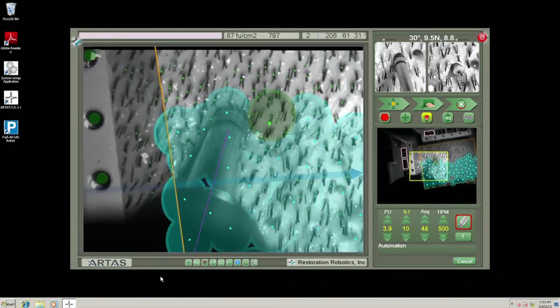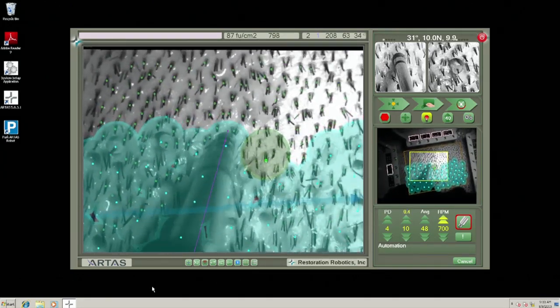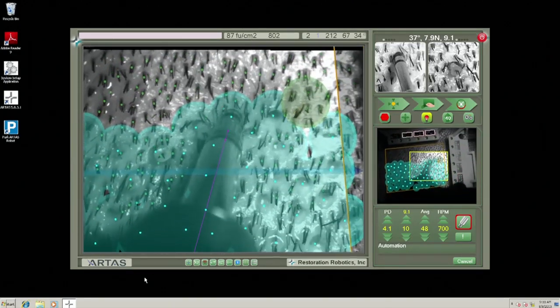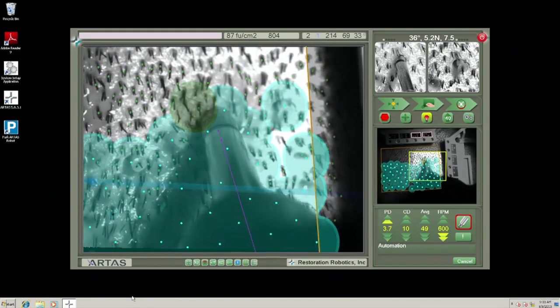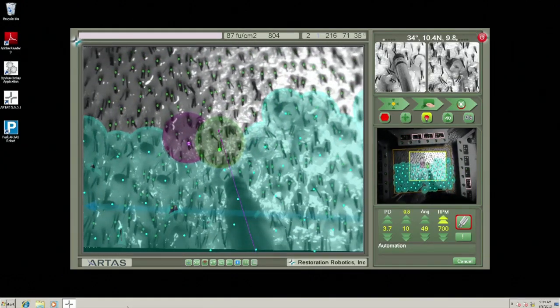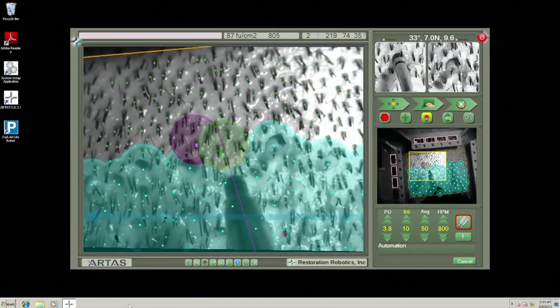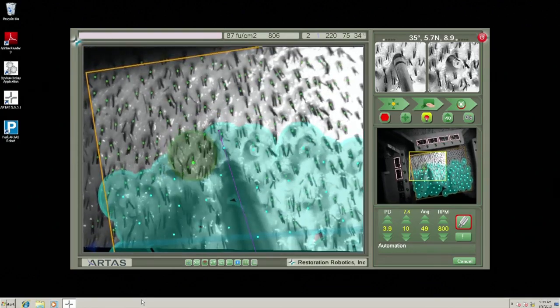Number two, if you're doing 1,500 grafts FUE or 2,000, like we'll routinely do, the difference in time in using a human model versus a robot is most likely not going to allow you to do an additional case during that day. It may allow you to finish 30 to 45 minutes earlier in some instances, but in our practice, it's pretty much about the same. Even being a very skilled FUE surgeon with my hands, I still don't think it speeds much up out of the day. It doesn't allow me to do 2 or 3 FUE cases in one day. I may finish 30 or 40 minutes before if I'm using my hands, but I get tired by Thursday. So operator fatigue is probably my biggest deal.